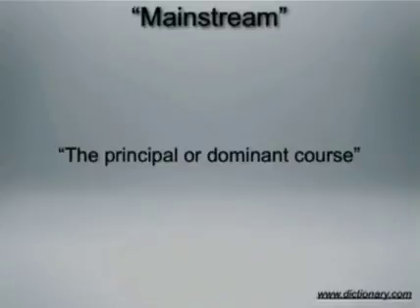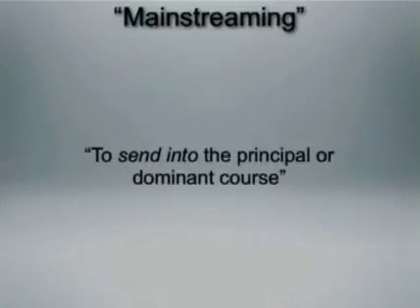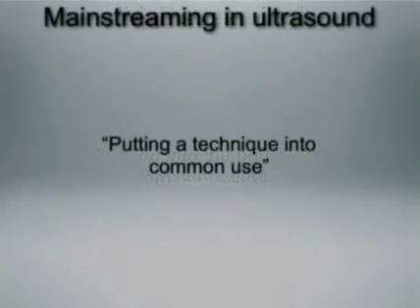The first jargon word or phrase that I used was derived from the noun mainstream, which dictionary.com defines as the principal or dominant course. Of course, if you looked at the title, you saw that I used the verb form of this, mainstreaming, which means to send into the principal or dominant course. What does this actually mean for ultrasound? Well, it's something I think we're all familiar with, especially if we've been practicing ultrasound for a while, and that's putting a technique into common use.